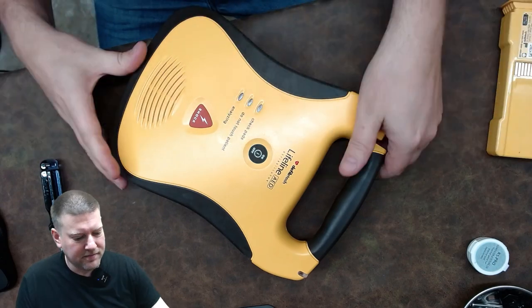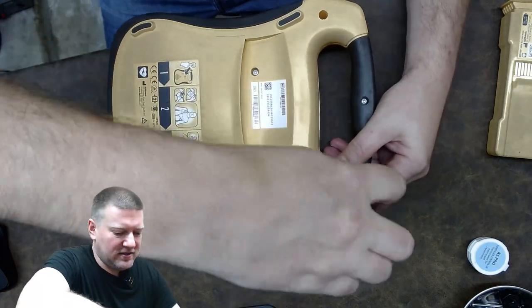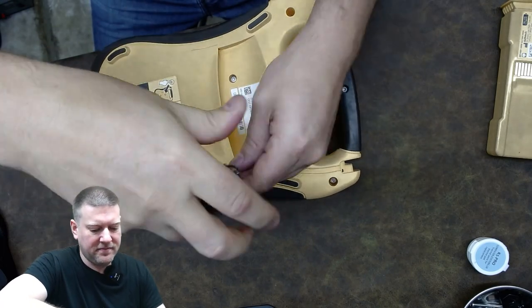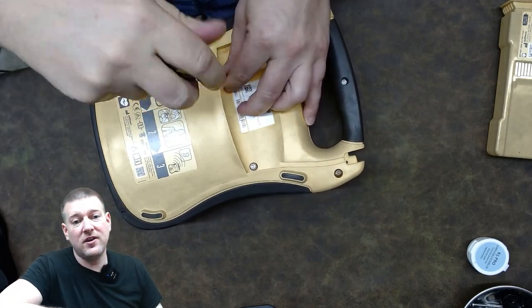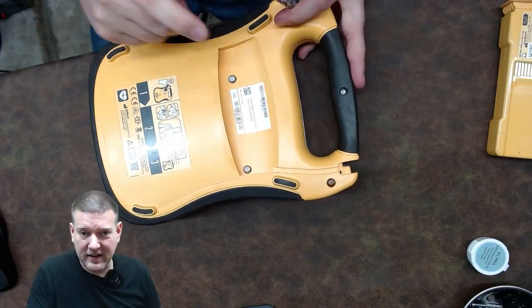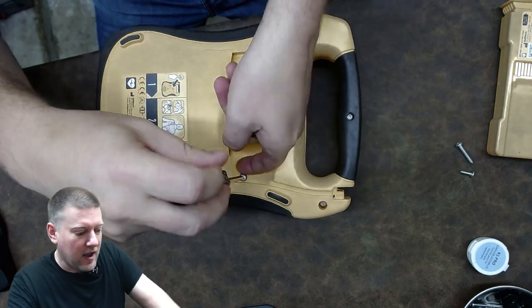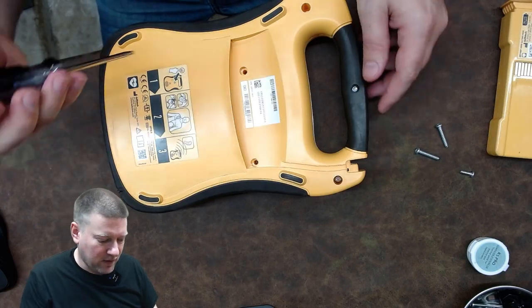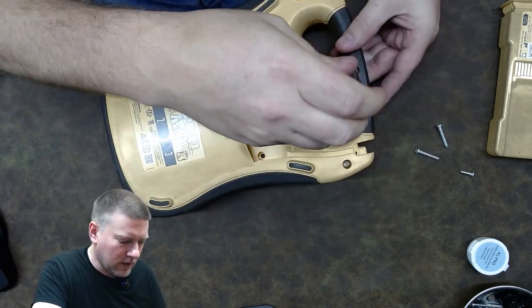There's the battery pack. This is going to be a T20 Torx. Let's open her up. Most medical devices hide fasteners under labels so they know if you've been inside goofing around, or they hide them under rubber feet. Luckily this one doesn't appear to use either of those approaches.